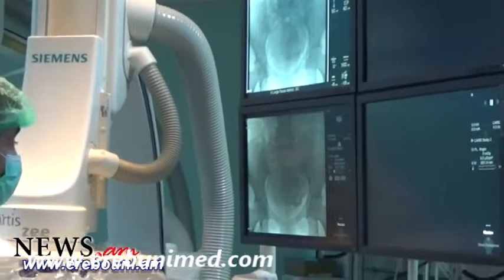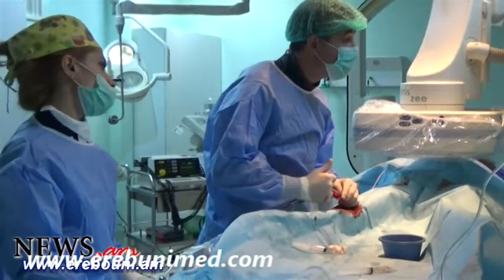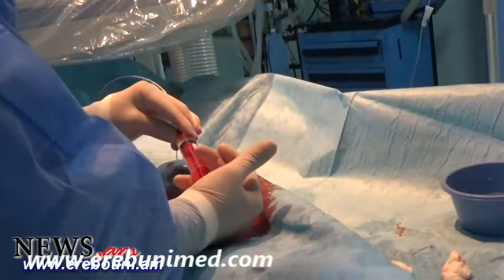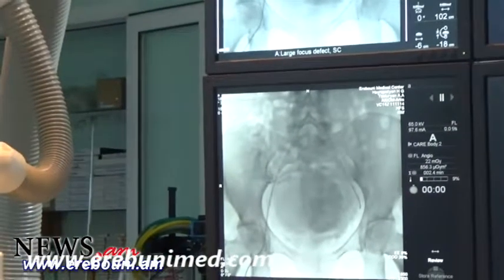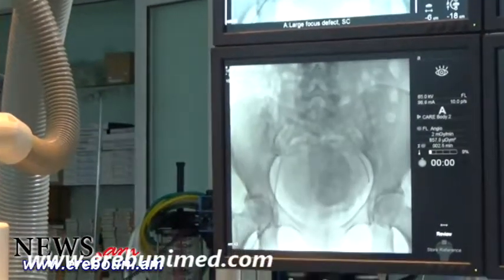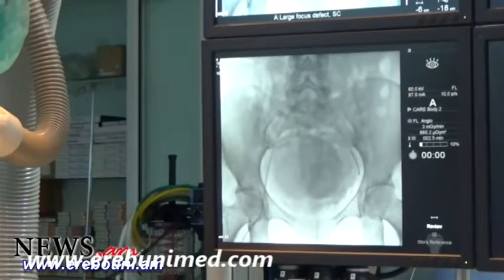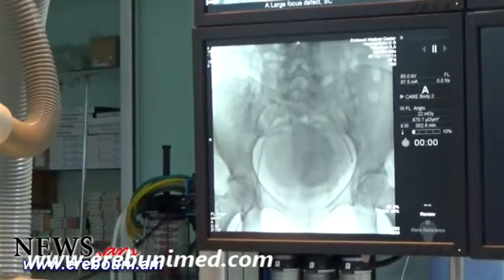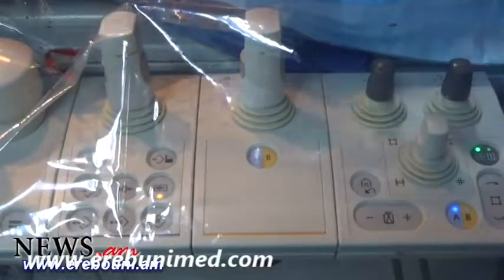Their size we choose according to the uterine artery and its branches diameters. We introduce the embolizing solution into the left uterine artery. It is necessary to perform this procedure under X-ray control to avoid solution backflow, which may flow to the arteries of different organs and cause undesirable results. This is called anterograde embolization.